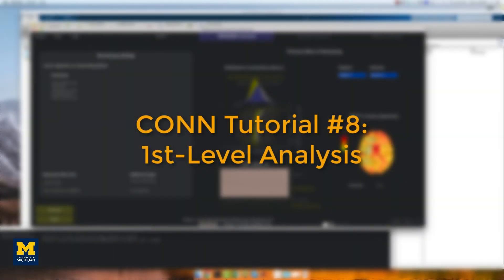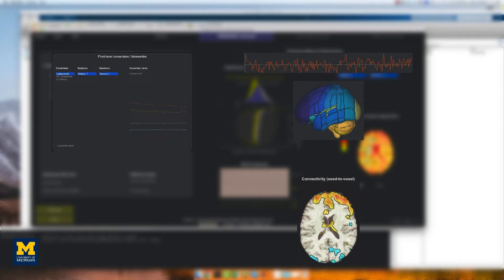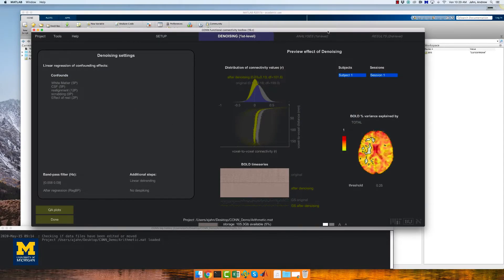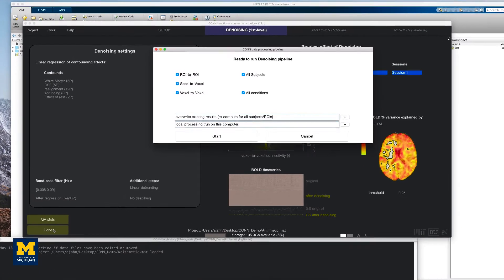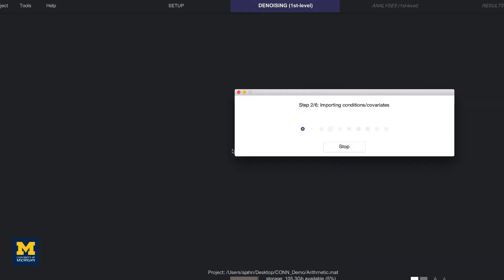The next step of our analysis is to create a first level model using the regressors in the denoising and setup tabs. After regressing out the confound regressors, a correlation value in each voxel is calculated by averaging across the signal in each seed and correlating it with all the other voxels in the brain. To run the first level model, click done from the denoising tab. Leave all of the boxes checked for now and click the start button. The toolbox will take a couple of minutes to denoise the data and generate each of the correlation maps you specified.